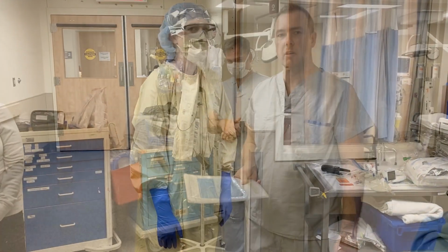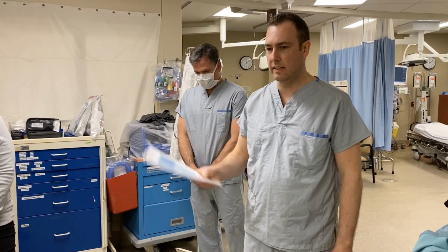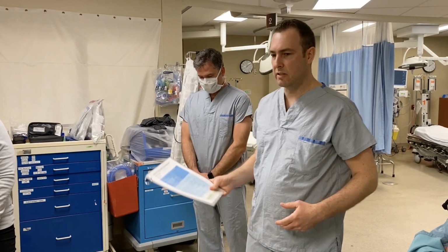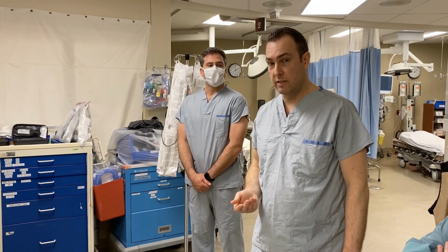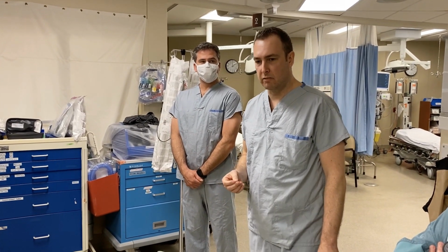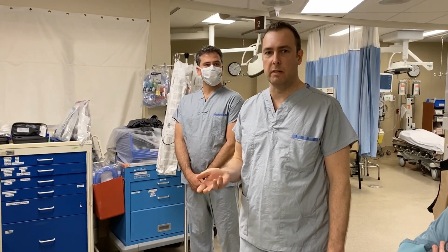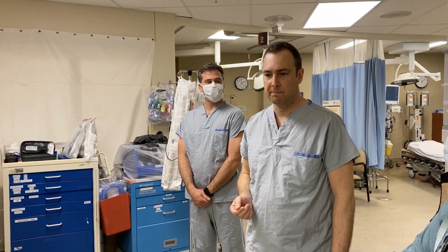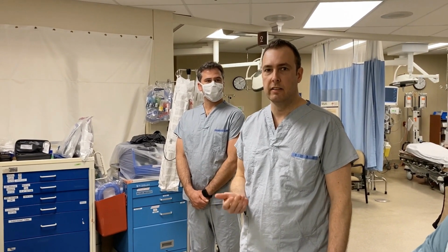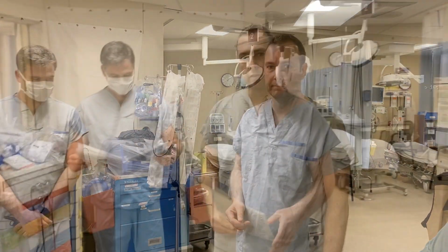Nope, it's good. Team of 3 that's going in the negative pressure room. So that's myself, Jacqueline, and Lacey. Guylaine and Mike will be in the ante room. The secondary intubator can play a huge role in this situation. They can confirm that we haven't missed anything on the checklist. And of course, if we run into any problems in airway, we would ask that they step in and help us out. Same with the second RN. If the patient unfortunately has cardiovascular collapse or becomes sicker, we have an extra pair of hands if we need them. Now our team's ready.